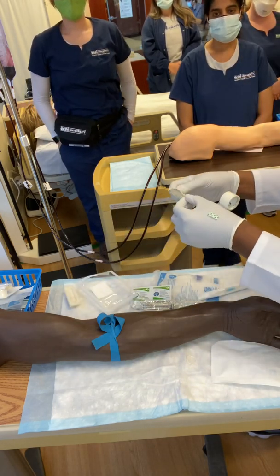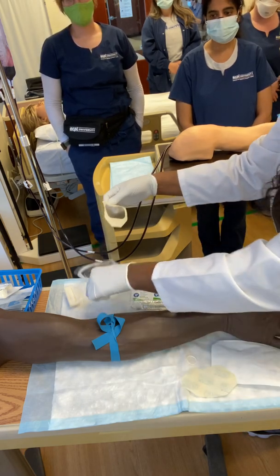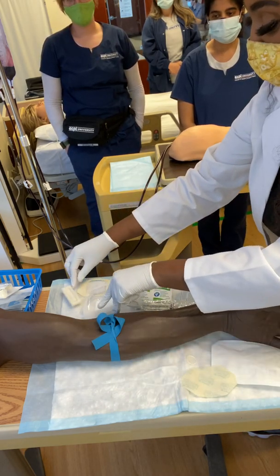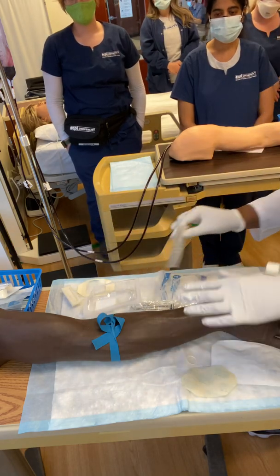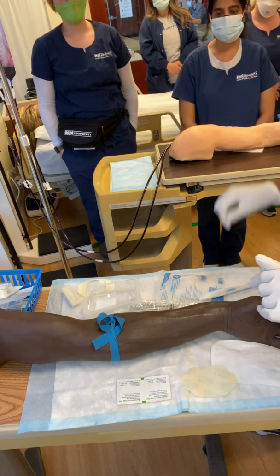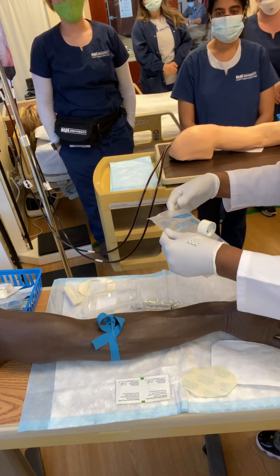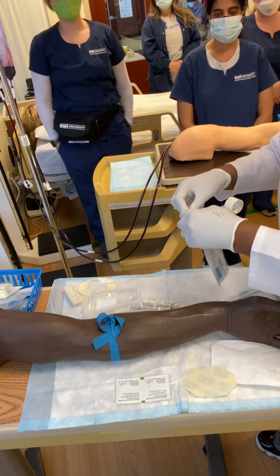Okay, so we have our outside here, or our Tegaderm. We're just going to take that off and get it all ready. So we have our Tegaderm, we have our gauze, we've got everything going on. All right, we don't need the alcohol because we've already got that. Okay, so now we're going to open up our extension kit.